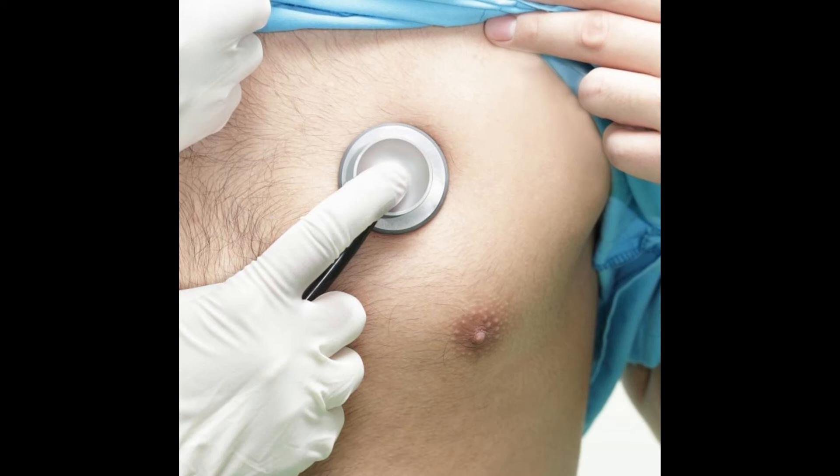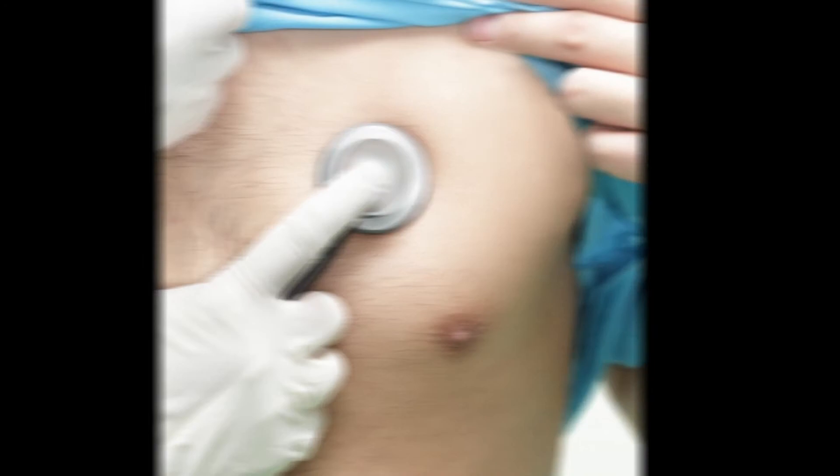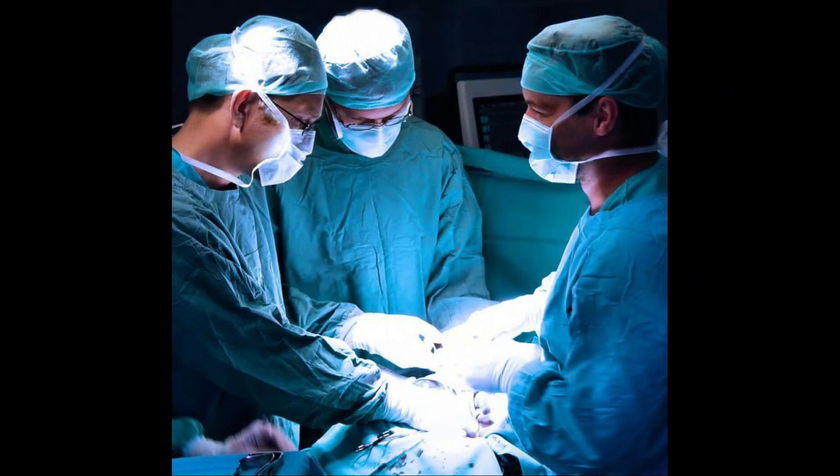One with a DDDR specification is generally implanted in both chambers of the heart and can coordinate function between atria and ventricles. Devices in this category tend to be among the most advanced and complicated available, and are often able to set a more accurate, dependable rhythm than those focused on only one chamber or those that are sensor-based and take their cues from a person's physical activity.